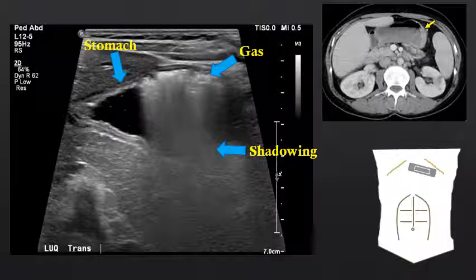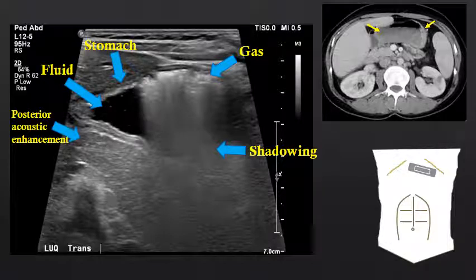Some people call the shadowing deep to gas dirty shadowing, but it is shadowing nonetheless as it is artifactual in its echogenicity and the structures deep to it are obscured. In the antrum of this person's stomach we can see fluid. The fluid-filled portion of the stomach does not result in shadowing; instead it results in posterior acoustic enhancement. The sound waves can pass through the fluid relatively unimpeded, and therefore higher amplitude sound waves hit those soft tissues deep to fluid-filled structures, resulting in those structures appearing hyperechoic.